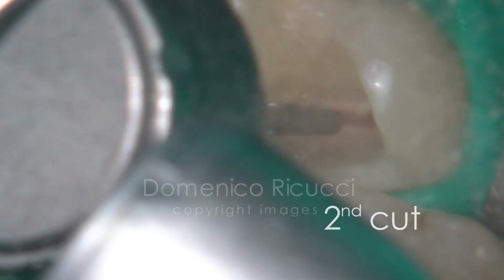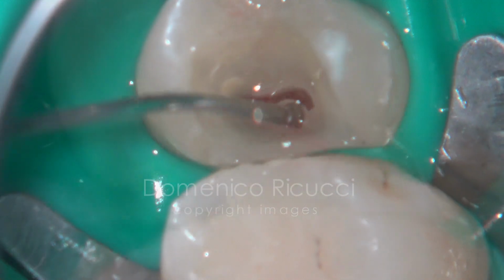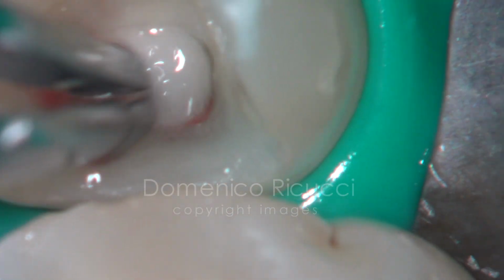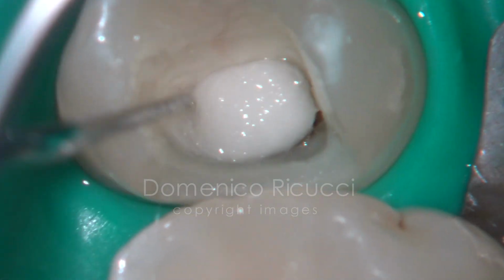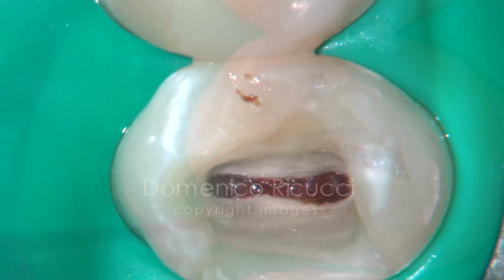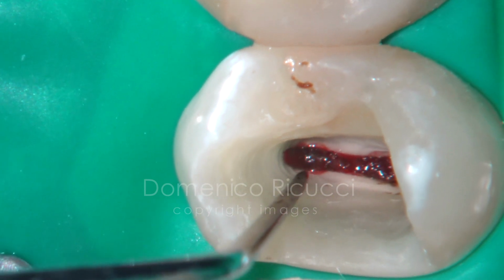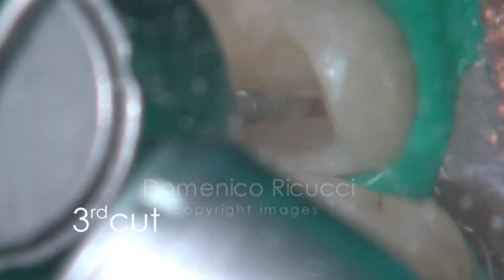The surgical procedure is extended more apically. Irrigation with 1% sodium hypochlorite. The wound is still irregular and the pulp detached from the wall. Pulpotomy is continued.